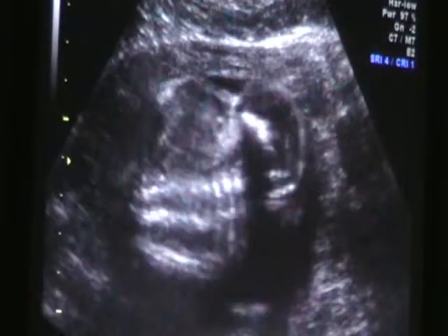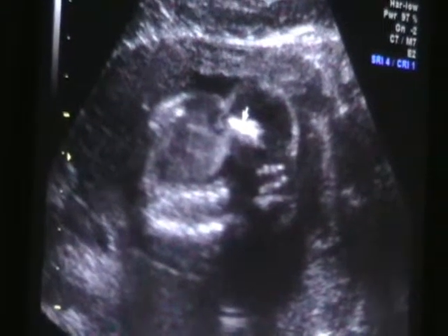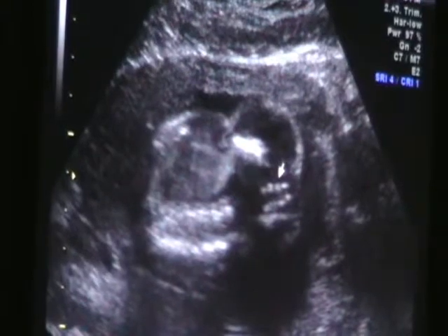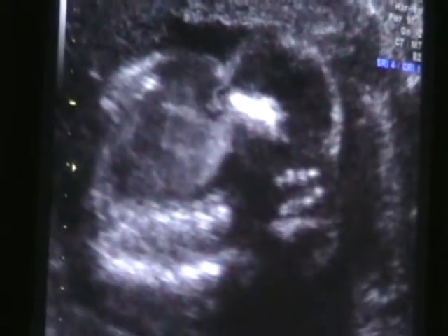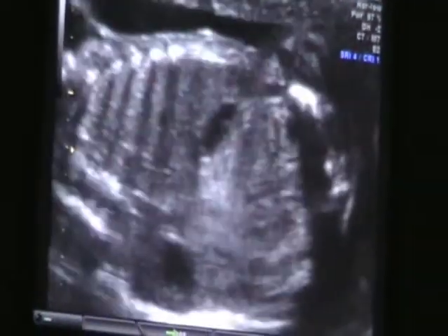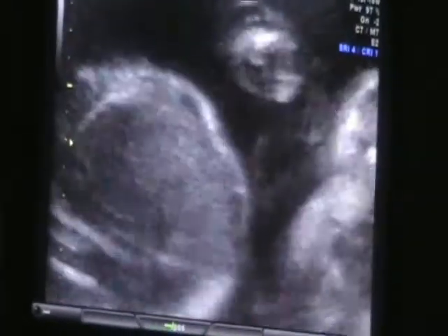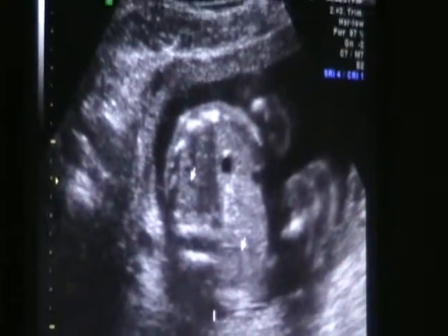This is her lower back. This bright thing here is her pelvis bone, just like on you. So we're trying to look at her spine. This is down by the tailbone. That's what we're trying to clear up — that she has no spinal problems. So if she could hold still just for a minute. I'm going to try to get a better picture of that, but that's one of the things we didn't see.